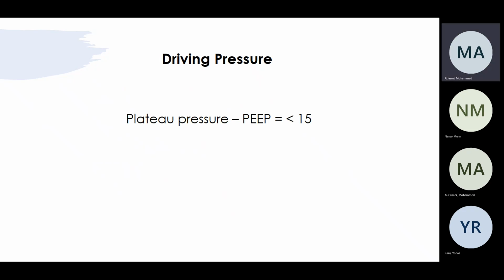What's the PEEP you said, sorry? We said the PEEP is 10, volume is 400, that's 6 ml per kg, ABG looks fine, PO2 is around 60. Saturation is around 91, 92. Peak pressure is 29, or is it 26? Plateau is around 25. Yes. Go up on the peak. Okay. I think you are stressing the lung more.